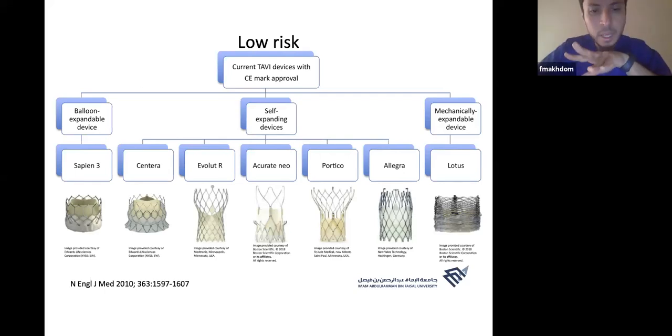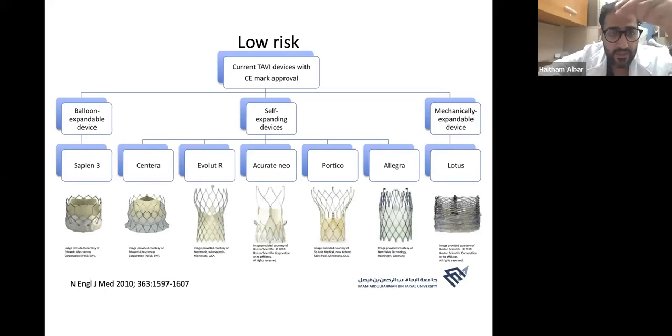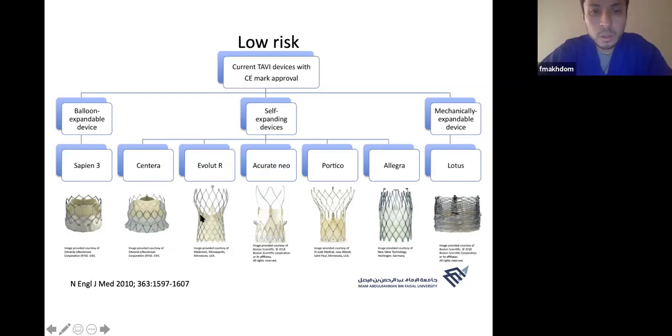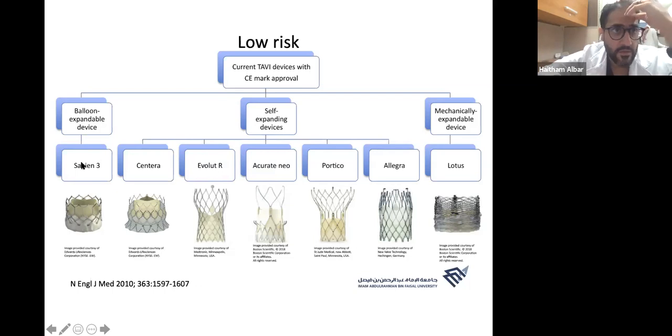CoreValve is Evolut. Yes, it is the same, from Medtronic. Evolut, the CoreValve, and the Evolut are from Medtronic. And Sapien. Sapien is Edwards, Sapien 3. So Evolut R is the latest CoreValve, and right now it is only Medtronic and Edwards.